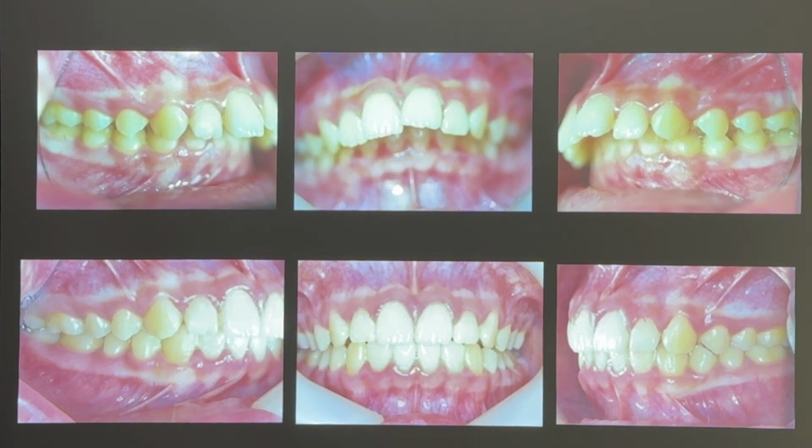But when I induce the lip seal with my hand, if the patient hits my hand, it means anatomical origin, not habitual. Okay?